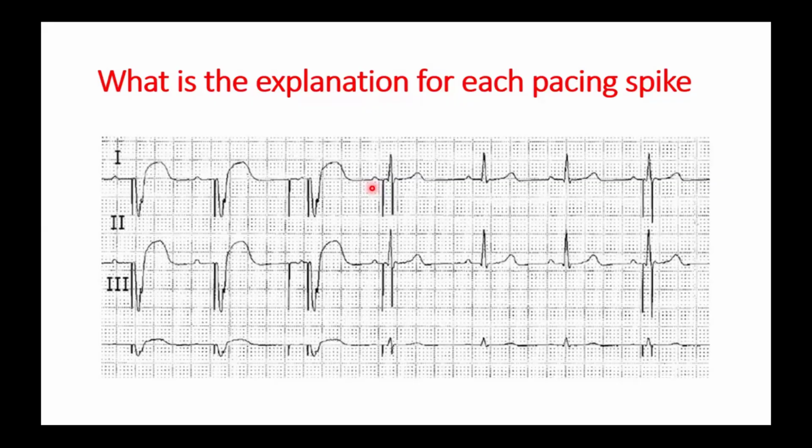Is there a difference between sensitivity of unipolar and bipolar in any machine in the atrium? Yes. Sometimes you can go down in bipolar to like 0.3, but in unipolar you cannot go down except to 0.5.